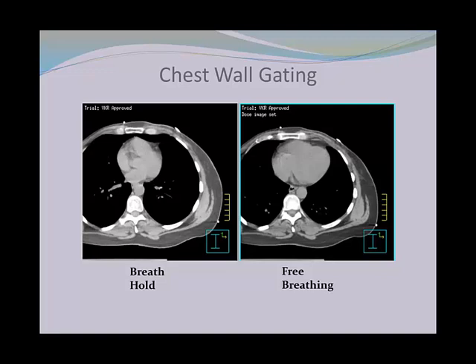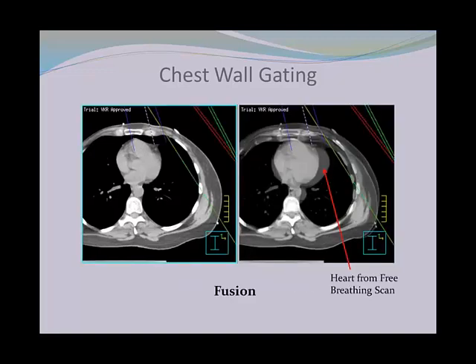Here in this fusion image, it's just showing you the difference between the breath hold scan and the free breathing scan. You can see how much closer the heart is in the free breathing scan.